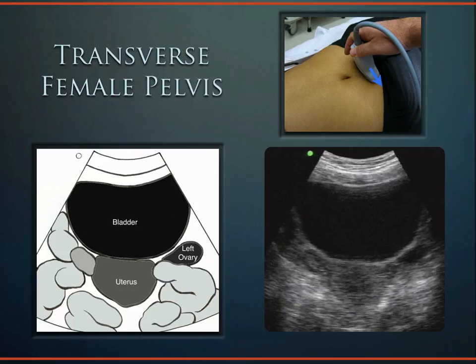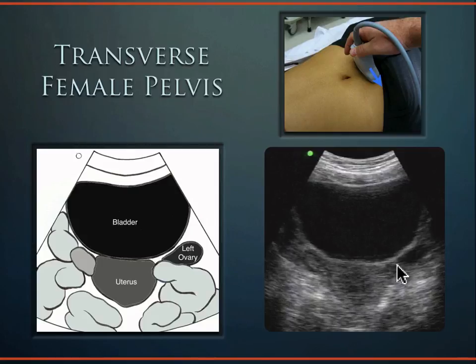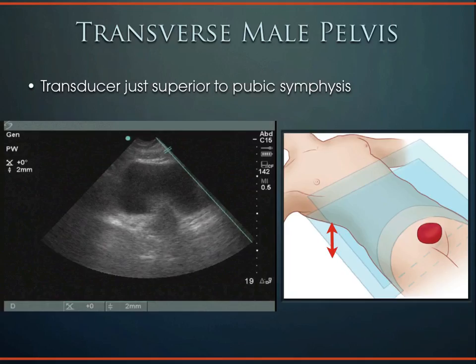In the female pelvis, a full rectangularly-shaped bladder is visible, and posterior to it is the uterus — which looks like a little koala bear face with the ovary as the ear. Can you see ovaries transabdominally? Almost always no, though occasionally in a very thin female with minimal body fat, a full bladder, and a very anterior ovary — especially if there's a cyst. Generally you need the endovaginal probe for ovaries.